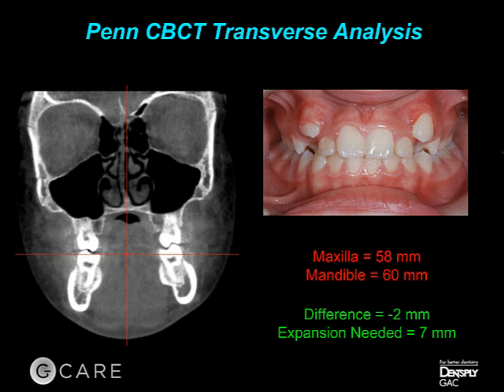Now, there are a lot of people that would say, oh, that's not needed. Well, if you take a look at our reference position of the mucogingival junction, look at the inclination of those lower molars, camouflaging the fact that the upper jaw is way too narrow for the lower. So this is something that you can all see clinically.